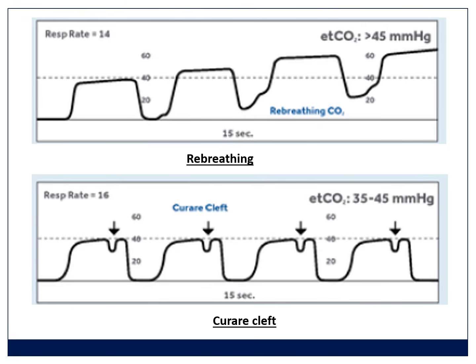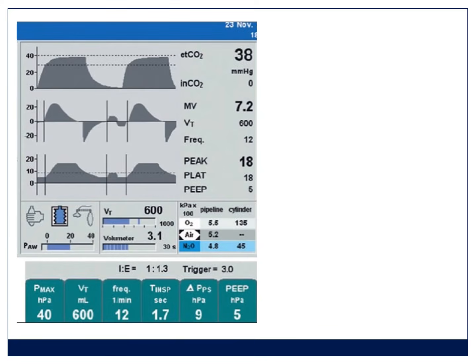And then this is called a curare cleft. And so when muscle relaxation wears off and patients start to breathe at the end of a delivered breath, you get that pattern. And there are lots of different patterns. That's just some that I've chosen. The message that I want to send to you is that you look at capnography traces and you use them to make diagnoses. And this is what you should do continually.